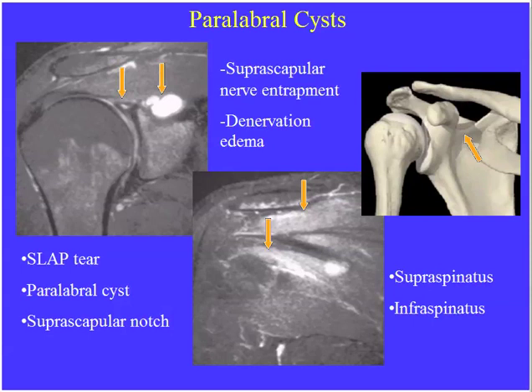They may also show one coming down inferiorly into the quadrilateral space, and they may show denervation atrophy of the deltoid and of the teres minor. And then you'd need to know that that was a quadrilateral space syndrome with axillary nerve entrapment.